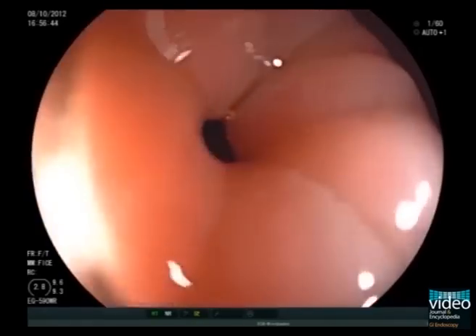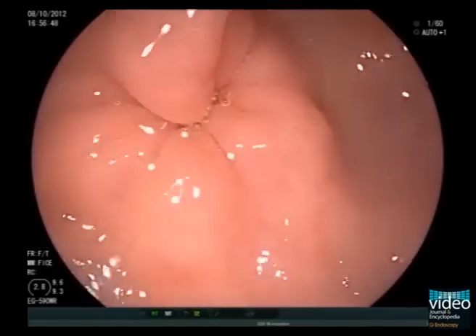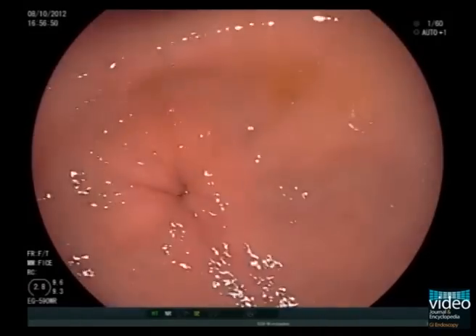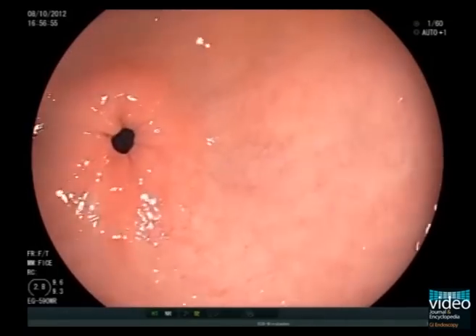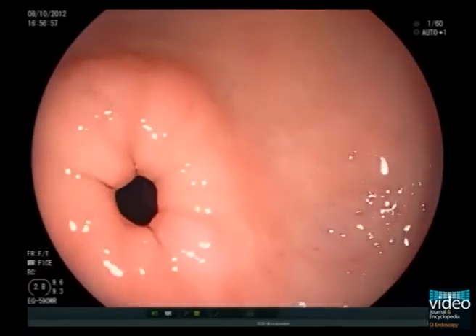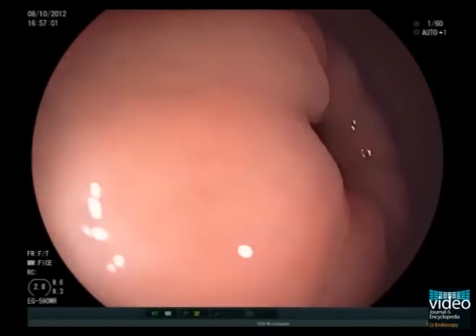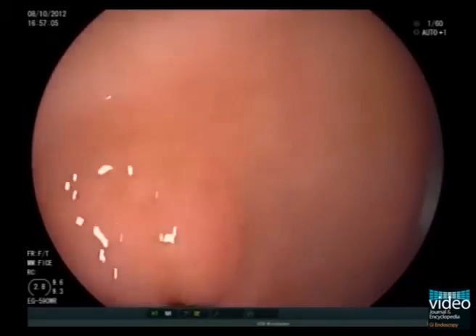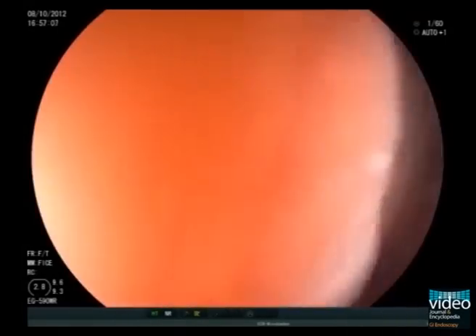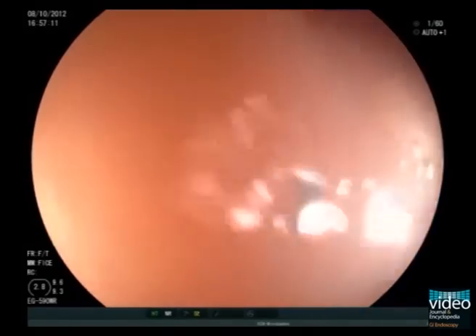So let us first move to the duodenum. The pylorus is examined closely with particular attention being given to its motility during peristalsis. Now intubate the duodenal bulb by advancing the tip of the scope as closely as possible to the pyloric ring and then applying gentle pressure.